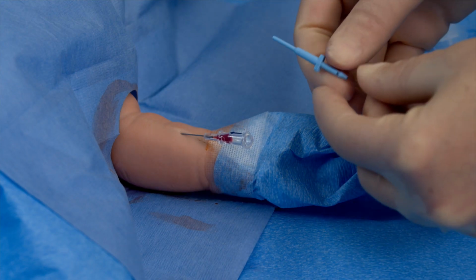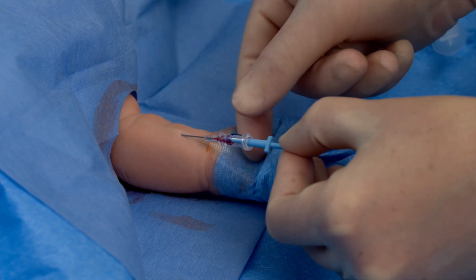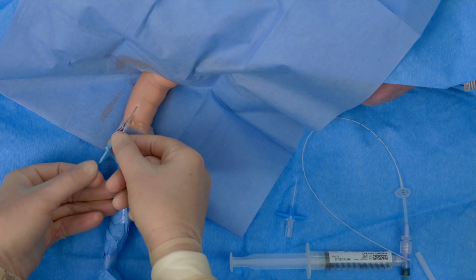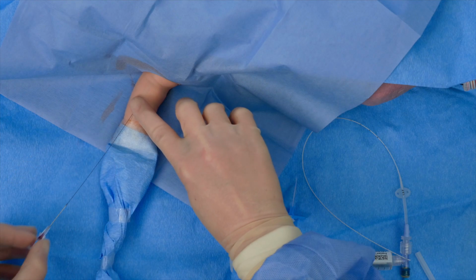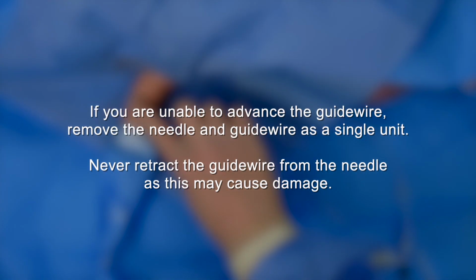Once you are confident that the needle is seated within the vein, thread the soft-tipped atraumatic guide wire through the needle, ensuring the wire is threaded beyond the tip of the needle 2 to 5 centimeters. At this point, you can remove the needle, being careful not to dislodge the guide wire in the process. If you are unable to advance the guide wire, remove the needle and guide wire as a single unit. Never retract the guide wire from the needle, as this may cause damage.